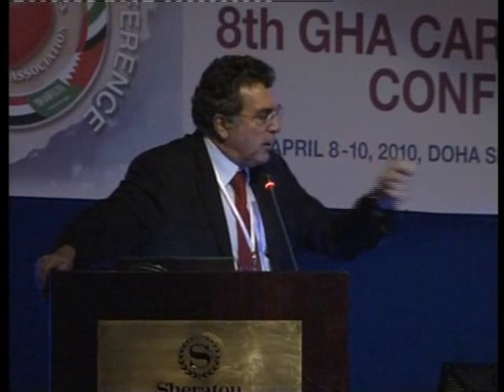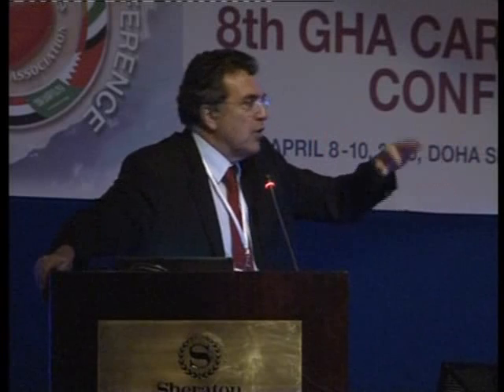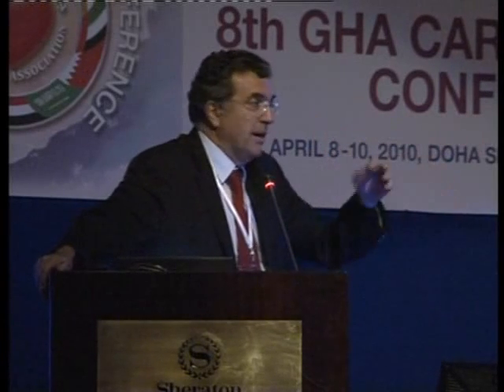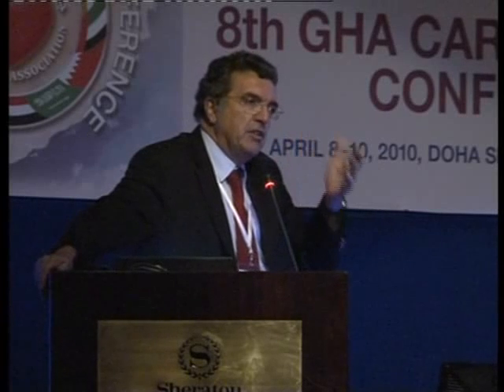The other point is the injection. The injection of adenosine could be done via intracoronary injection, and we inject around 100 micrograms. It varies from 70 upward, but in fact the dose does not impact the gradient very much. This is suitable for the assessment of a single lesion in the vessel.